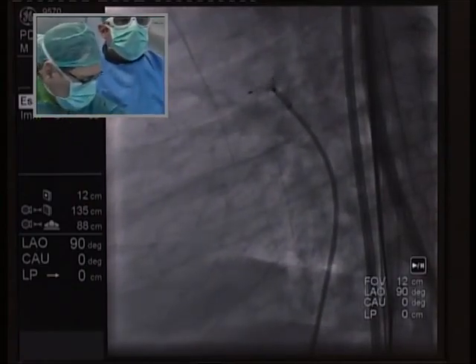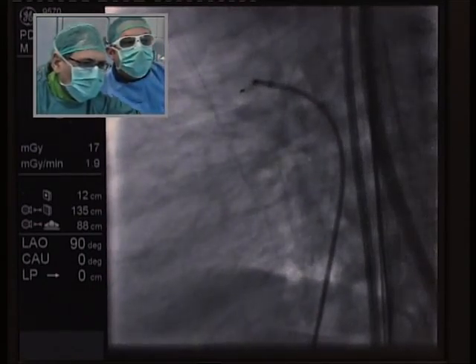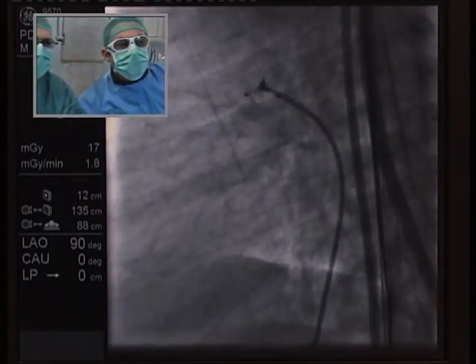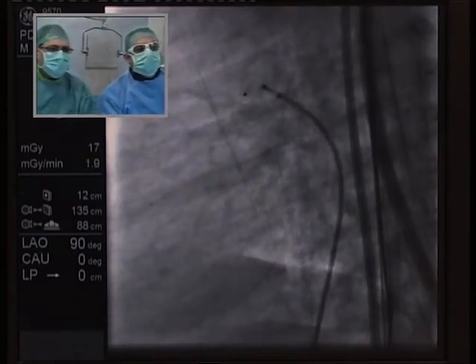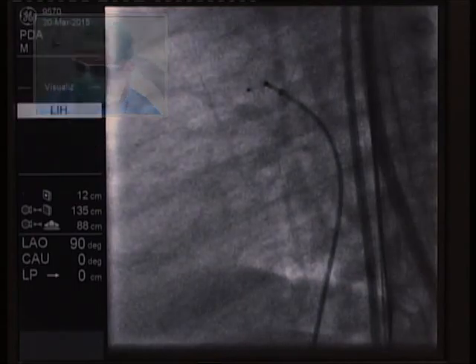Yeah, so you're making a comment that maybe there's spasm of the duct. Yes, I think with a 2.5 millimeter duct, this child might not be failing to thrive so much. And because the tubular ducts do have a tendency to go into spasm, I think we just need to confirm. It may not be; it just came as an idea.